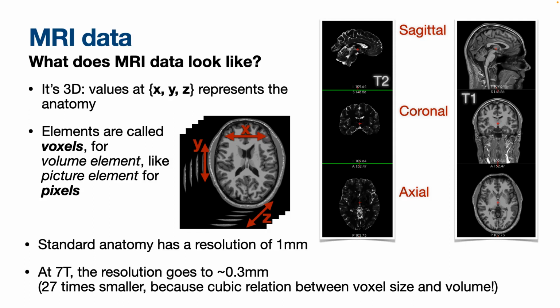Yeah, and it has neighbors on all sides, and together they make up a three-dimensional image. Right? We have three dimensions, X, Y, and Z. Now, this is also something that people use in hospitals, and doctors, they like fancy names, right? And so there are specific names for looking at these 3D images. Like if you're looking at a specific direction, it has a name. And I don't specifically like this sort of rote learning, but it's important for you to know these different directions.